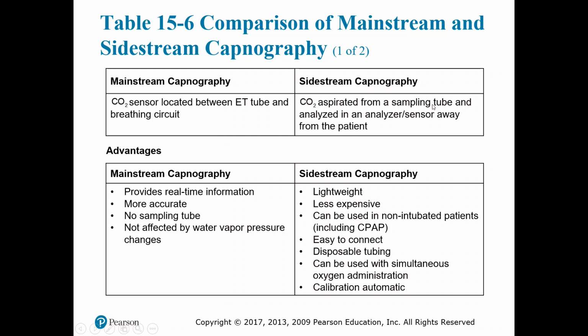Whereas side stream takes a sample of the gas through a sampling tube and analyzes it in the analyzer that's away from the patient. So there's a distance there, and there's some dead space in that line that needs to be taken up before it gets to the sensor. Now, side stream capnography is generally lightweight. It's usually combined with another monitor that you're carrying with you anyway.